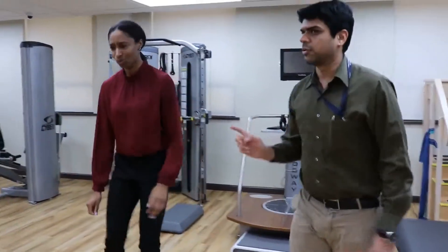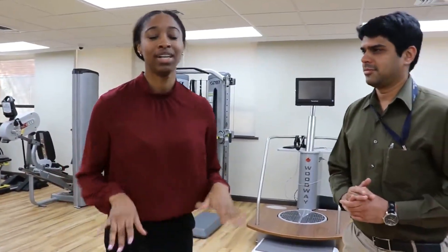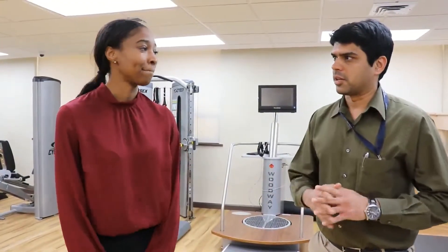How did you feel when you were walking there? I felt like I was walking on heels. It's very challenging but it forces me to strengthen my ankles — but it feels good. So you're focusing on each step as you take it? Yes.